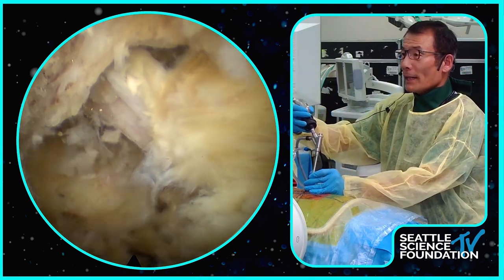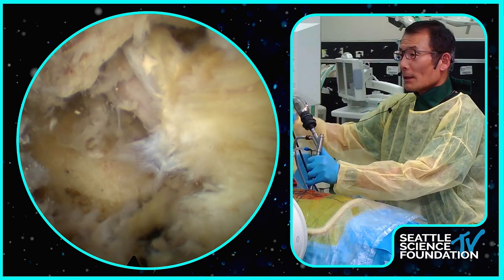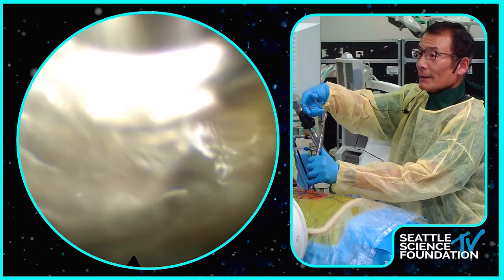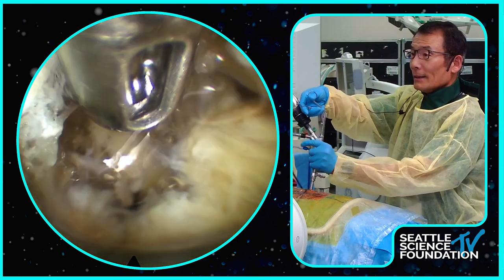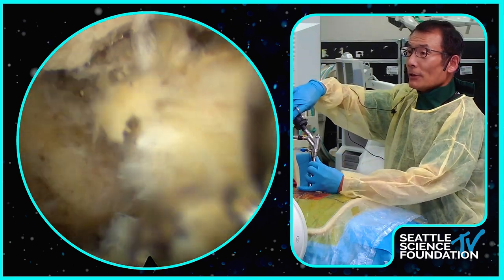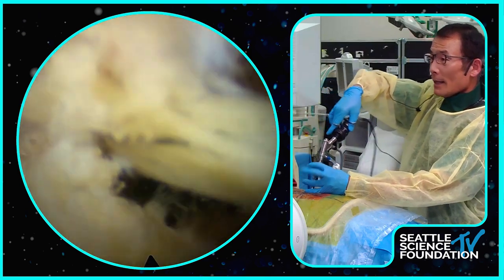Let me show you where the pedicle is. Can I have a grabber? Where now I turn my scope distally. See, that's the L5 end plate. The pedicle you can feel just right there, okay?